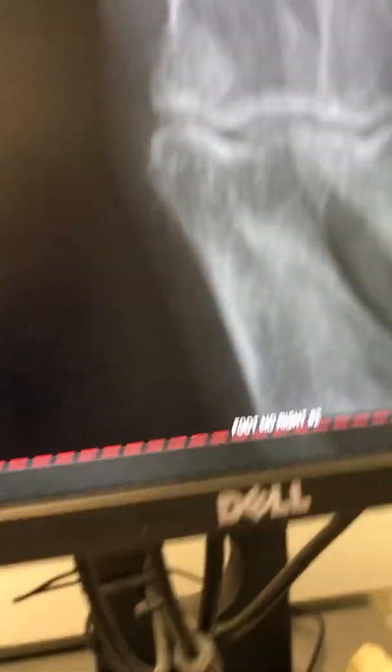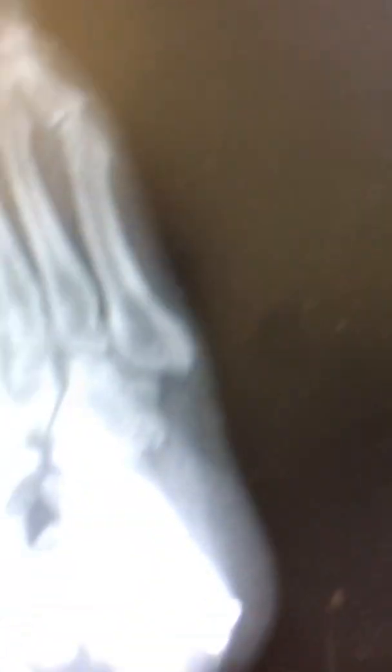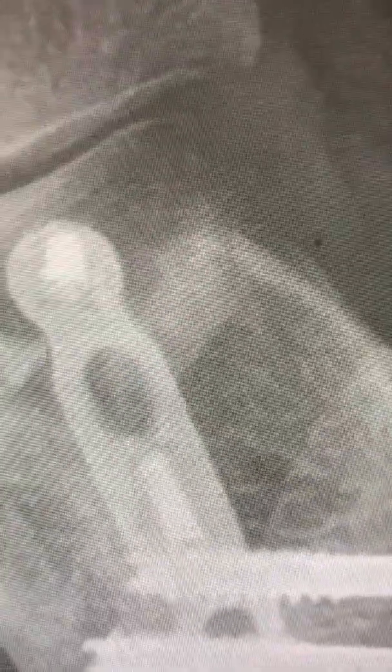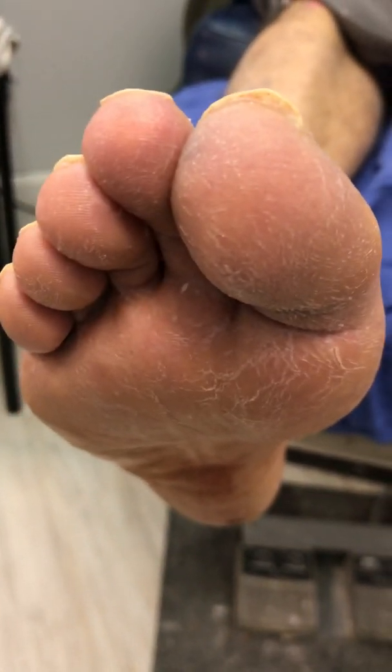When we look at the graft, as we can see right there, it's a fairly large-size graft and it's stabilized with what's called a neutralizing plate. Some people use staples, others use pins, others use screws — you're trying to relieve the compression forces off the graft to avoid crushing it. Otherwise, this looks great. Flat foot reconstruction.